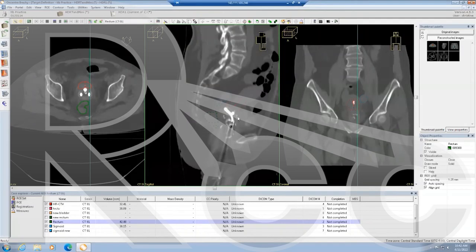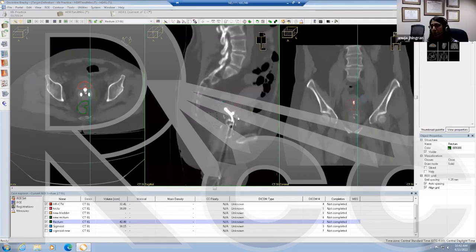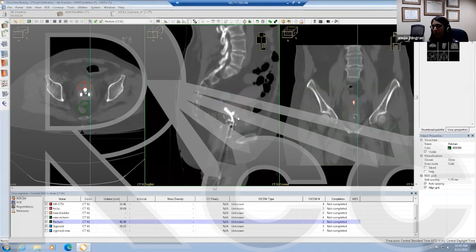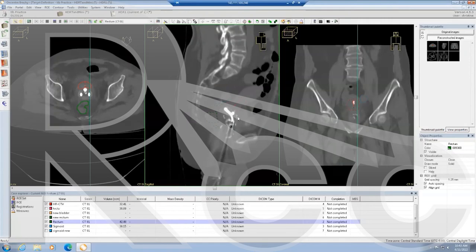What do you contour when there's no disease at the time of brachytherapy? You contour the entire cervix — that is the HR-CTV. The cervix plus whatever disease you feel at the time of brachytherapy. If there's no disease left, you still contour the entire cervix and your HR-CTV doses may be very high because the cervix could be only 2 cm in size.